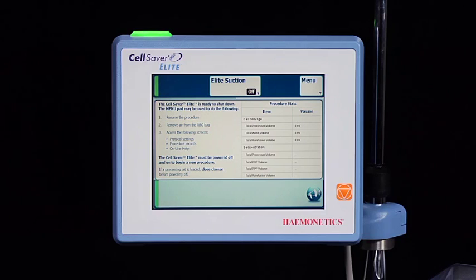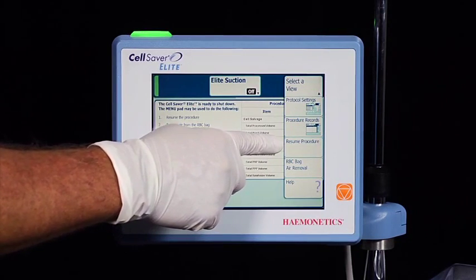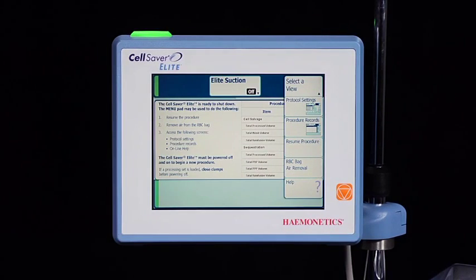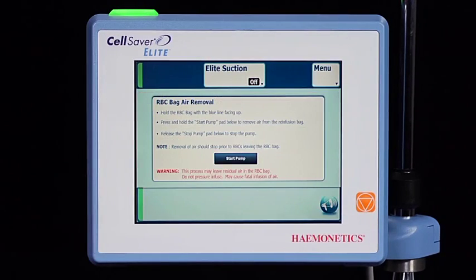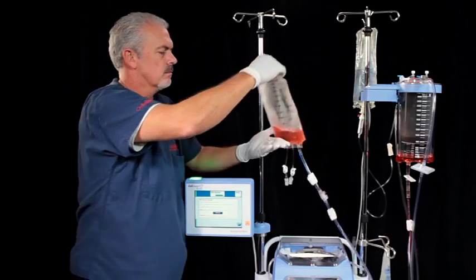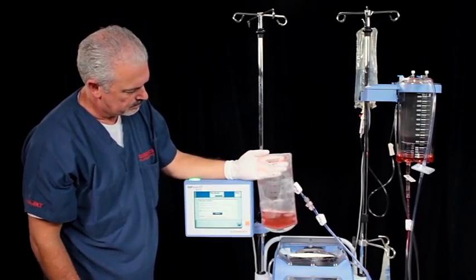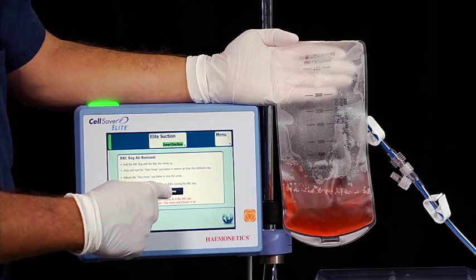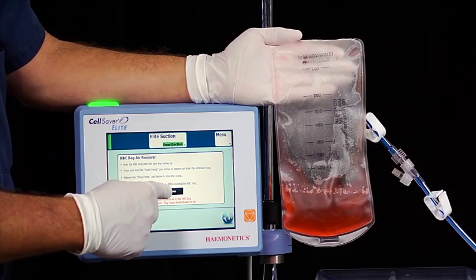While on the Procedure Summary screen, the user has a couple of additional choices on the menu. The user can choose Resume Procedure, which will take them back to the procedure screen. The user can also choose RBC Bag Air Removal to remove air from the reinfusion bag. To remove air from the reinfusion bag, the user must hold the reinfusion bag upside down while pressing the Start Pump button. The pump will only remove air while the Remove Air button is being held down.